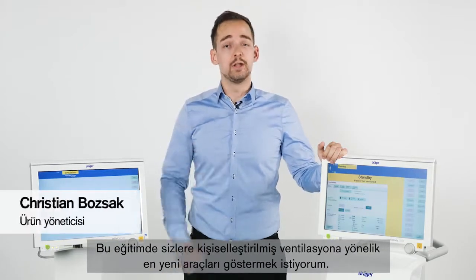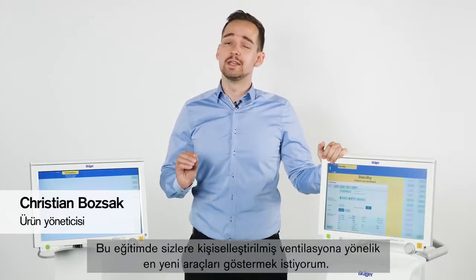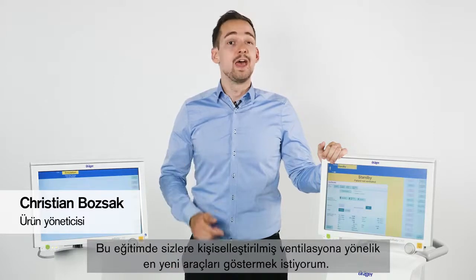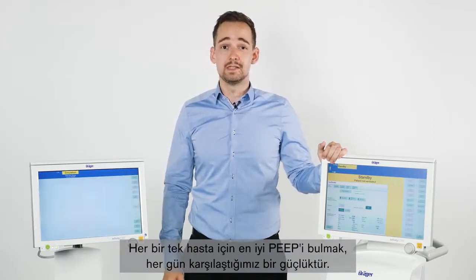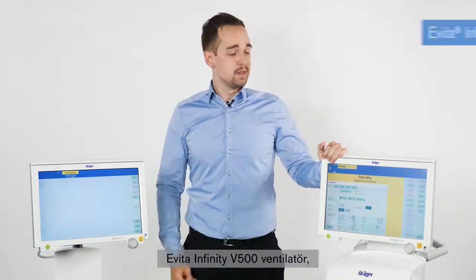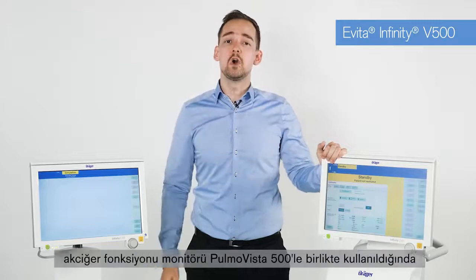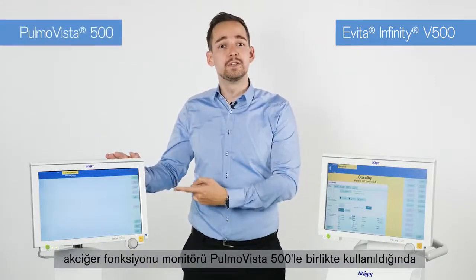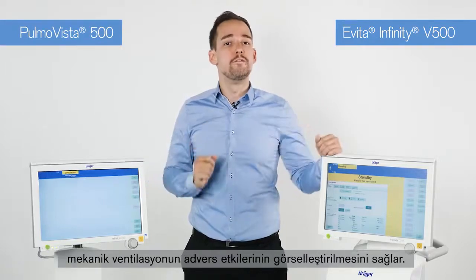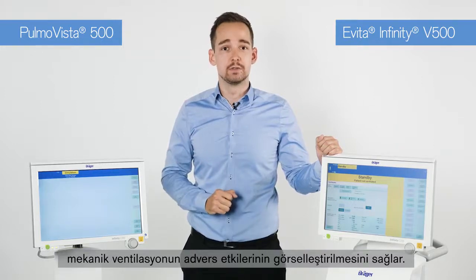Within this tutorial, I want to show you the latest tools for personalized ventilation. Finding the best PEEP for each individual patient is a daily challenge. The Evita Infinity V500 ventilator, in combination with the lung function monitor PulmoVista 500, allows to visualize the adverse effects of mechanical ventilation.